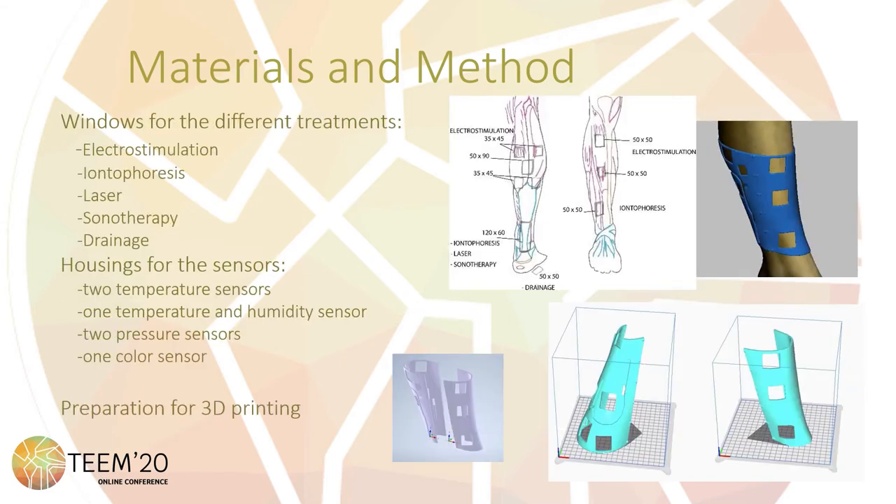By using a 3D parametric design program, different windows for the treatments are created. The considered treatments are electrostimulation, interferential therapy, laser, sonotherapy, and range-of-motion. Also at this point, different housings for the sensors are created. The considered sensors are two temperature sensors, one temperature and humidity sensor, two pressure sensors, and one color sensor. When the design process is completed, the part is cut into two different parts to make it possible to fix it over the limb, and it is sent to a 3D printer.